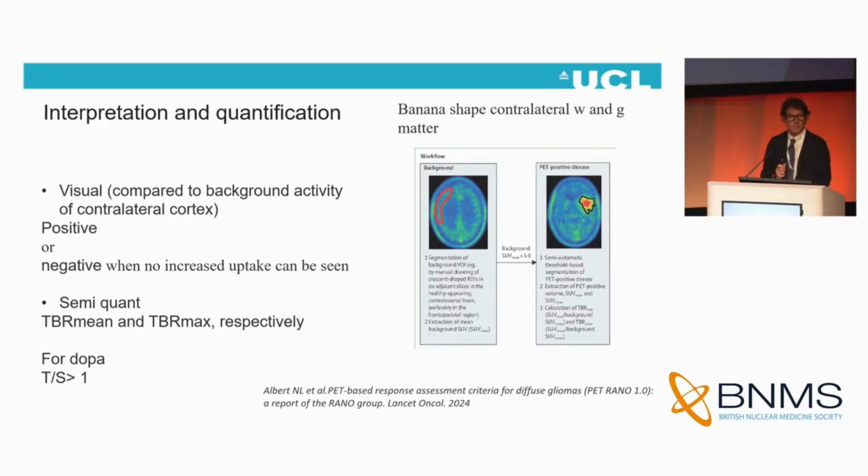How to report the scans? Of course, visually you can dichotomize into positive or negative, with negative meaning no increased uptake in the tumor, or you can provide a semi-quantitative evaluation. SUV max can, of course, be reported, but it is not mandatory.